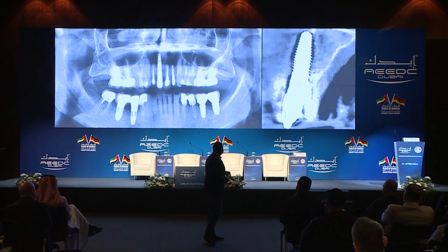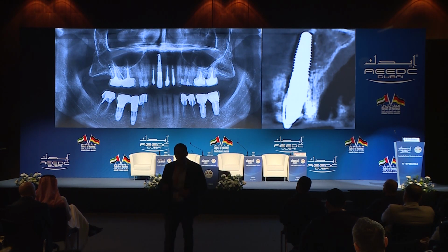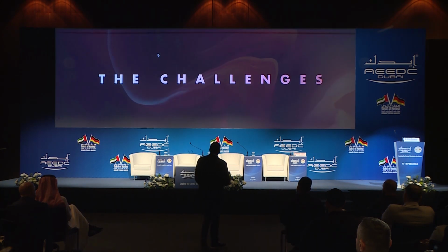Because when you look at this case, take a CBCT, look at the implant, completely off, right? No buccal bone, no soft tissue. In a 79 years old, are you going to remove the implant and try to do all this again? Take her through bone graft, soft tissue graft, 2 years of treatment, many surgeries. Are you going to do this? No. So what can we do?